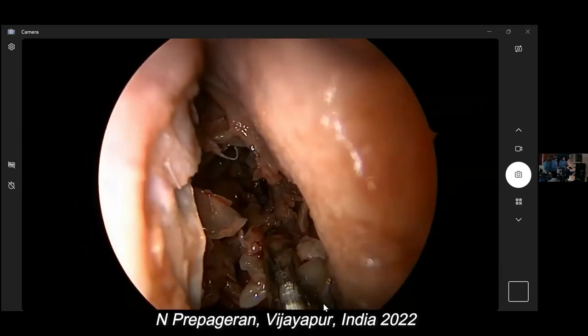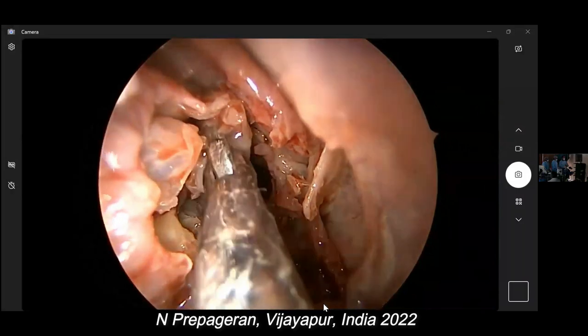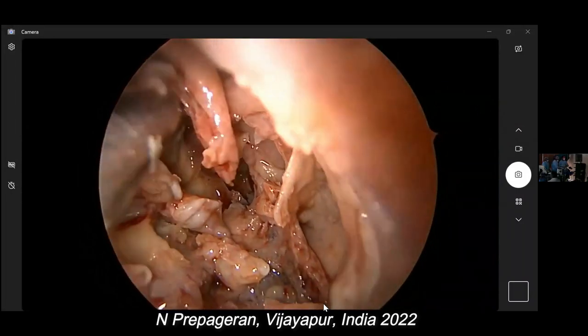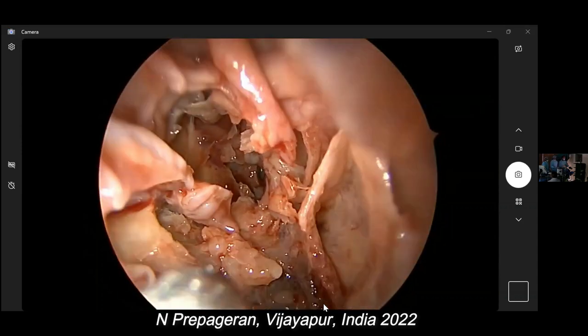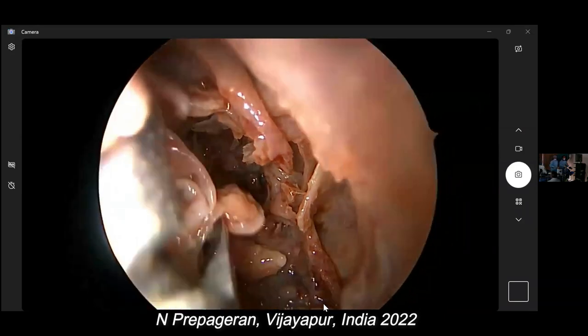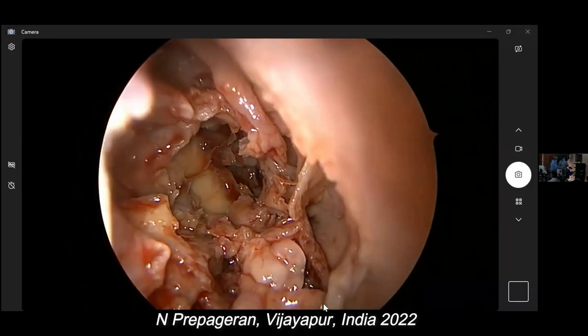So what you want to do is remove the mucosa of the skull base. That's the skull base up there. Okay, so if I remove the mucosa so that we can see the skull base, you've got to keep right there. I'll use it for the other side. So now you can see the periorbita. You can see the lamina papyracea. You can see the orbit.